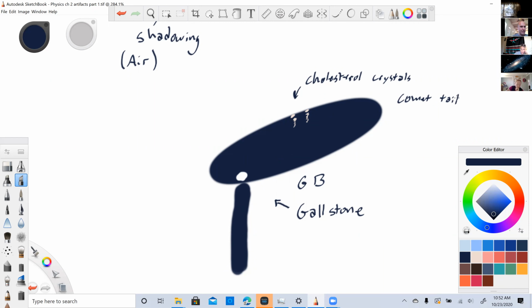Oh, why not? This is actually a good opportunity. Sometimes we get air in the gallbladder. And depending, if it's a lot of air, all bubbles along, we'll have dirty shadowing. If it's a single bubble of air, I guess I can kind of imagine why this would happen, but sometimes a single bubble does the opposite of dirty shadowing and creates a ring down artifact.